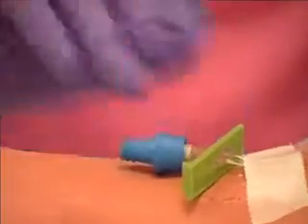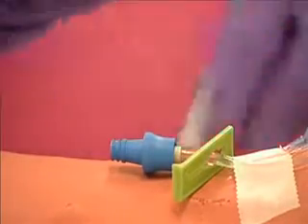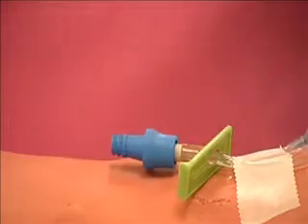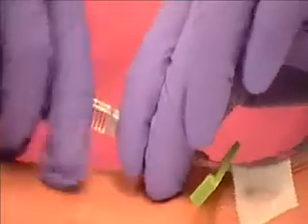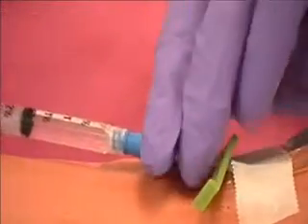Clean injection port of lock with antiseptic swab. Insert syringe containing normal saline into injection port of IV lock. Pull back gently on syringe plunger and look for blood return. Flush IV lock with normal saline by pushing slowly on plunger.